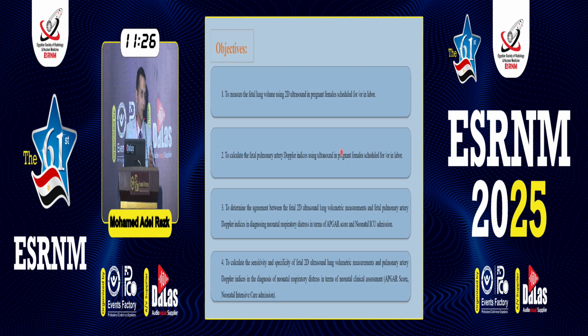The objectives of our study were, first, to measure the fetal lung volume using 2D measurements. Number two, to measure the pulmonary artery Doppler indices and the pulmonary artery diameter, and to combine the results of each fetus and correlate them with the clinical data. In this case, the APGAR score assessment and the neonatal admission to the ICU, and even whether he needed any respiratory support, such as an oxygen mask, CPAP or even mechanical ventilation.